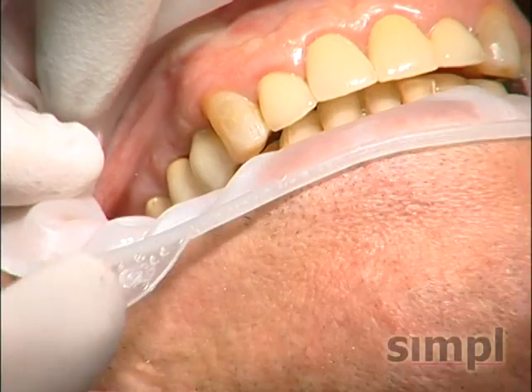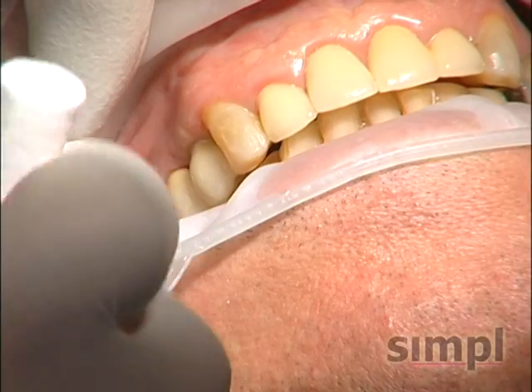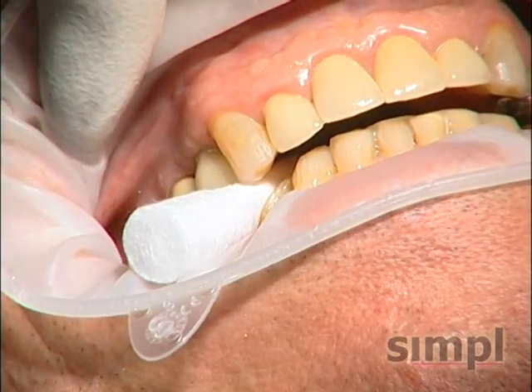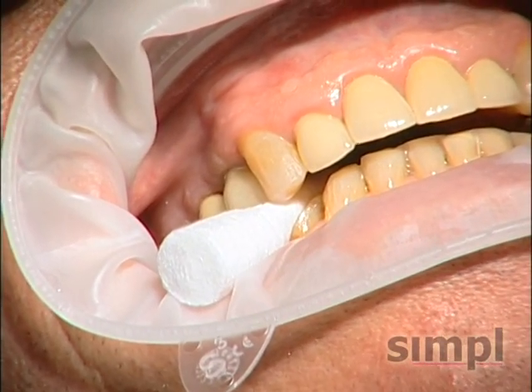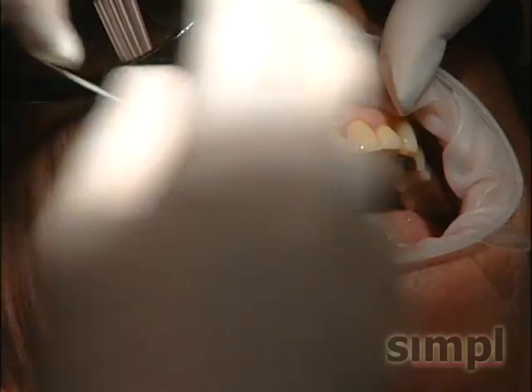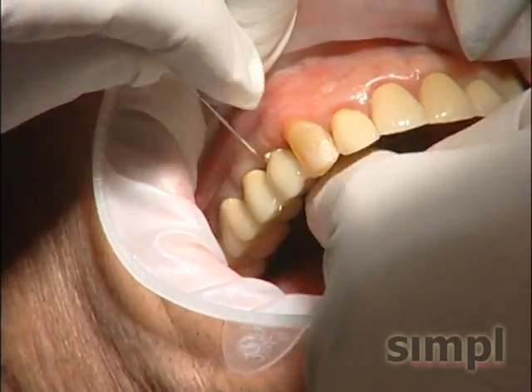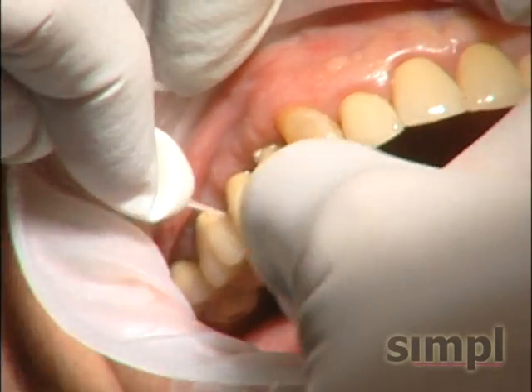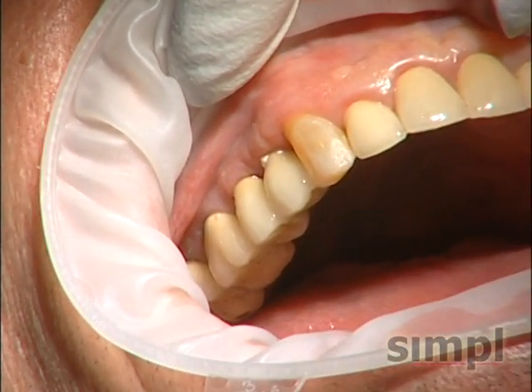And bite down all the way, close. Great. Open. And bite down. And we'll let that seat for about 2 minutes till the cement sets. We got nice snug contacts around the implant, so we don't have any cement. Scaler, please.